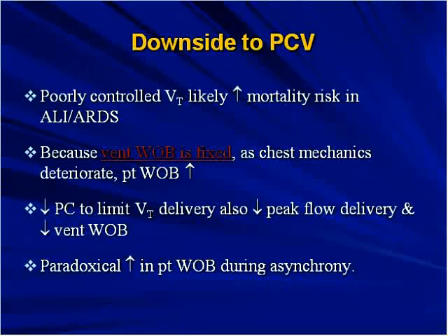Unfortunately, there's a downside to pressure control. And a lot of this relates to ventilator-induced lung injury and attempts to do lung protective ventilation with pressure control, is that we have poorly controlled tidal volume in pressure control. So the more tidal volume they want, they can get it. It's compassionate, but unfortunately it increases the mortality risk from lung injury.